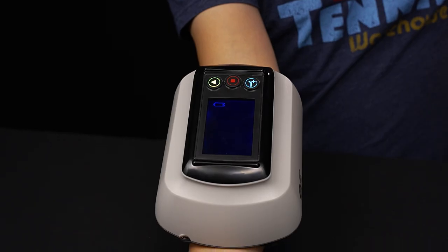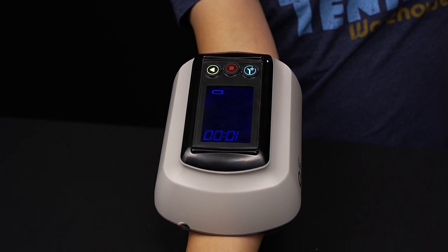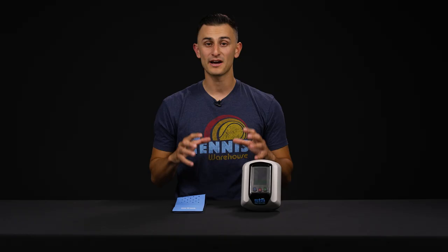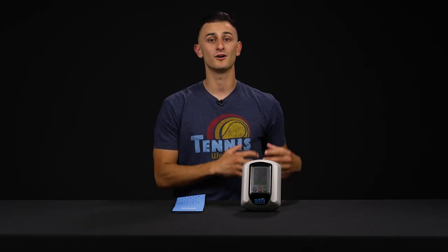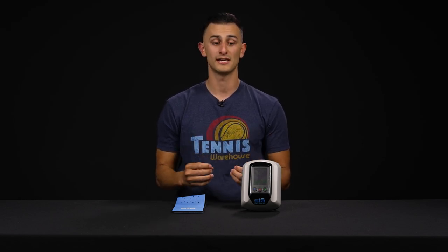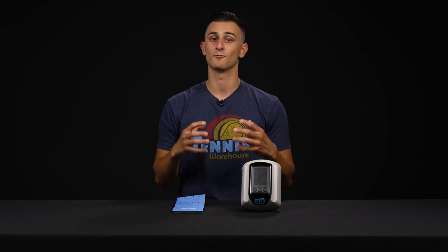A lot of you are probably wondering what happens to the device after the eight weeks — you've healed, you're back on court. Well, now you have the building blocks and a program on your phone for any future flare-ups. So this is something that you can use if you have even a small amount of pain — you have everything set and ready to go.